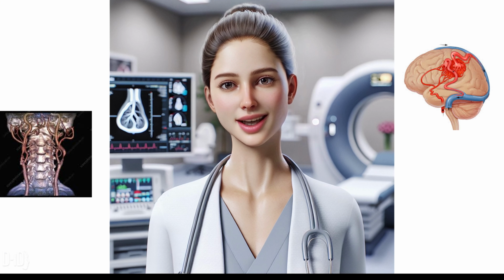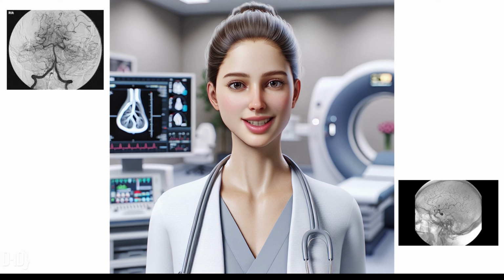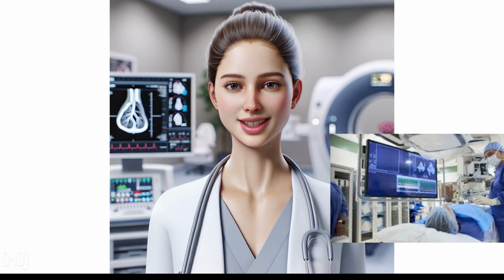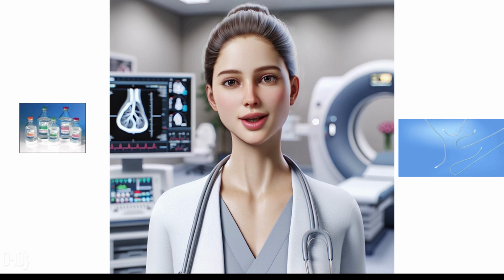A cerebral angiogram is performed in a specialized room designed specifically for angiography procedures. The room is equipped with advanced X-ray machine and computer systems to visualize blood vessels in the brain with the help of a contrast dye injected through a catheter.